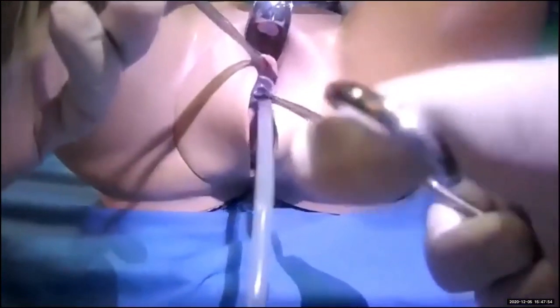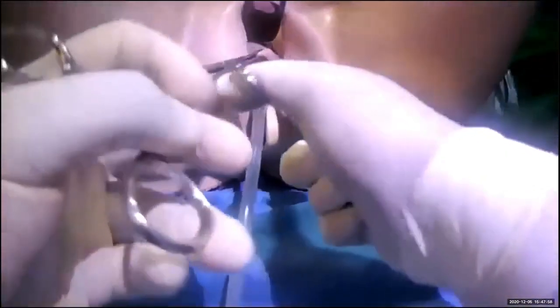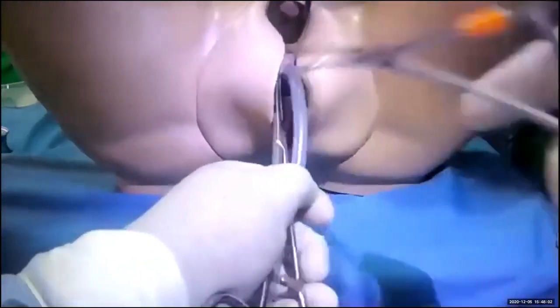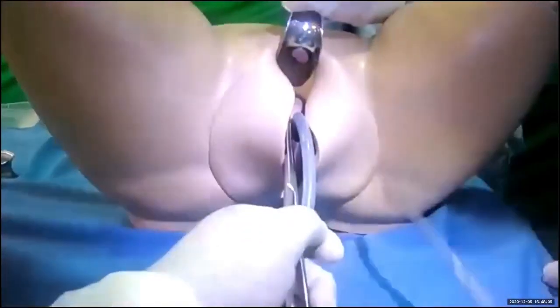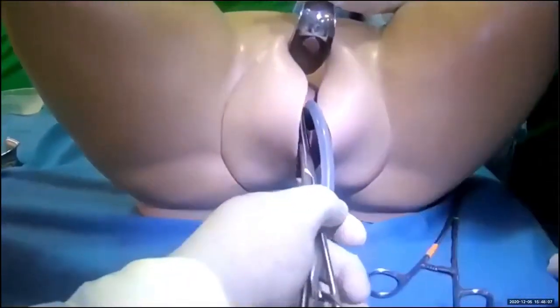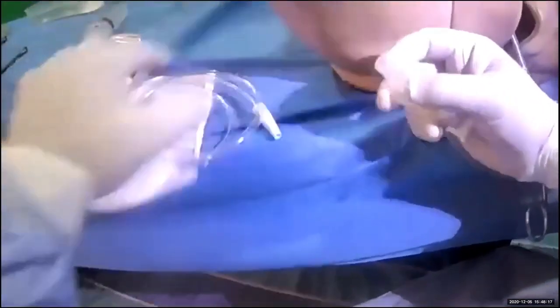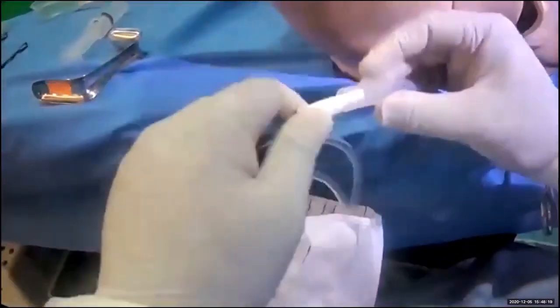Under direct supervision, gently introduce the balloon into the uterine cavity. Once you feel the resistance, you can confirm this via an ultrasound. Please make sure you are inside the cavity before you infuse the fluids. Then you may place a bag to drain the fluid from the dependent part of the cavity — connect the bag to this orifice.